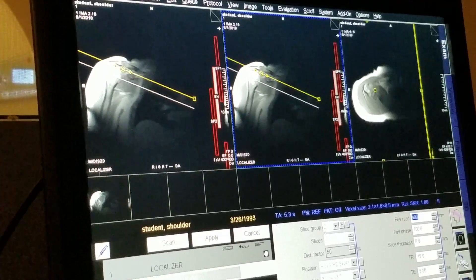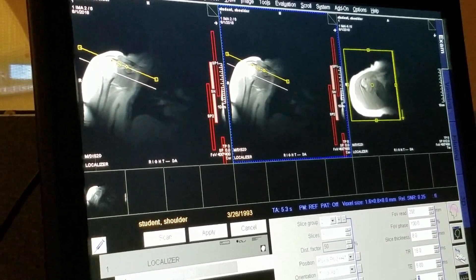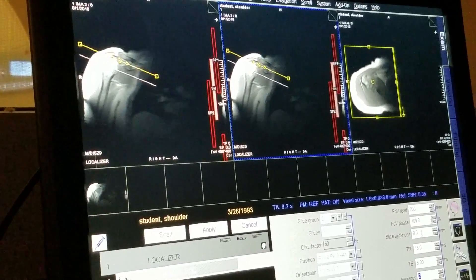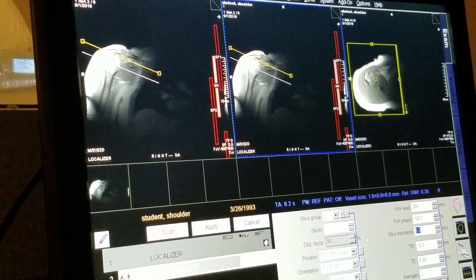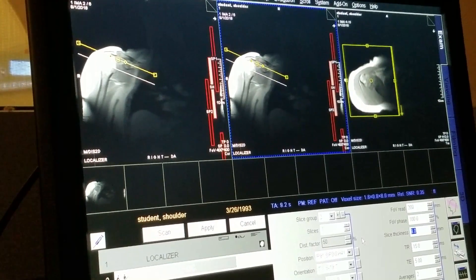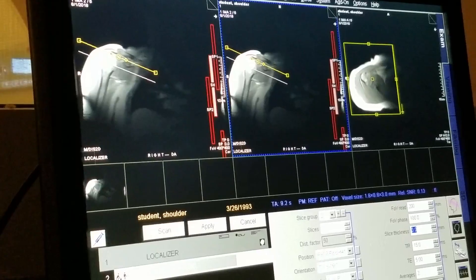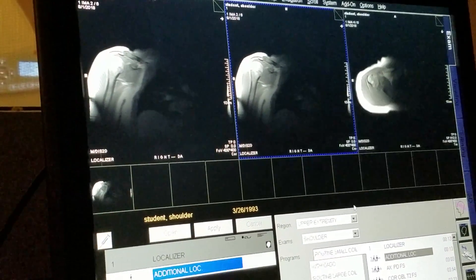Shrink your field of view down. You can even add an average if you want. You can even go down your slice thickness because eight millimeters might be a little too big up there. Don't worry about your signal to noise — these are localizers. And apply that and let's see what we get.